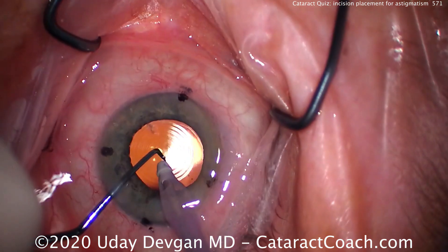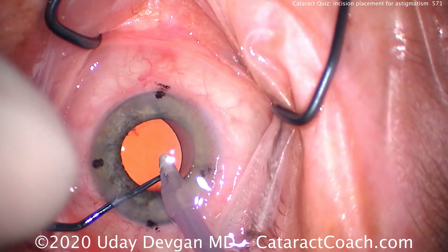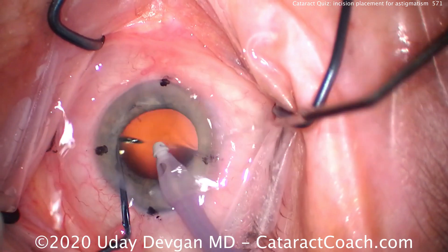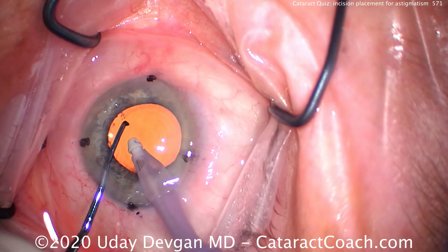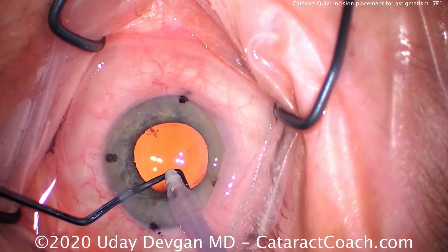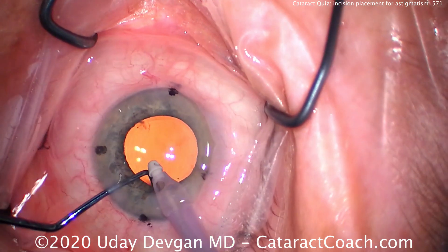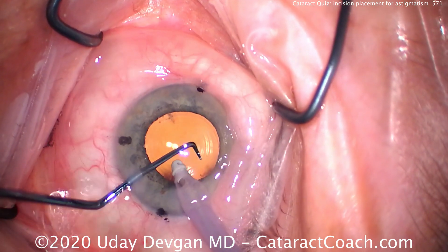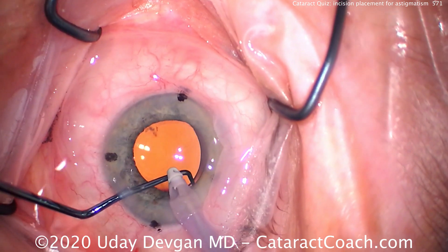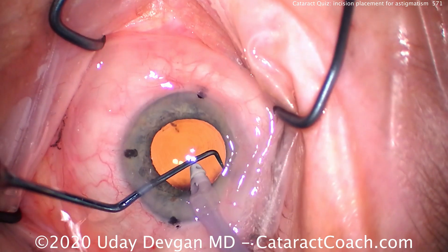The worst choice is to make your incision at some other axis, oblique to the steep or flat axis. The reason is that will not only change the astigmatism, it'll also change the meridian. So instead of having steep at 30 degrees, if you had made the phaco incision at the 180 degree mark, the incision would shift the meridian from steep at 30 to maybe steep at 20, 18, or 22.